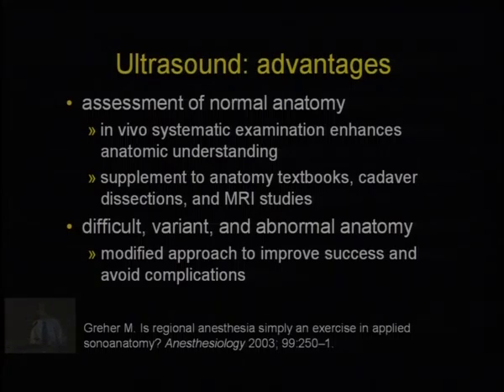The ultrasound images also can be used to supplement anatomy textbooks, cadaver dissections, and MRI studies. And the advantage in patients with difficult anatomy or different anatomy or abnormal anatomy can be very obvious. One can use a modified approach to improve success and avoid complications.